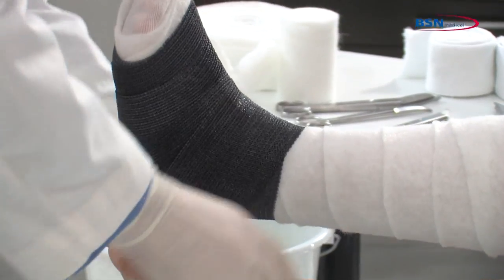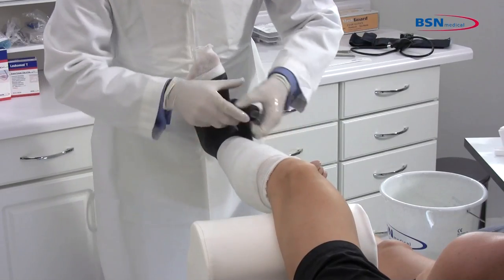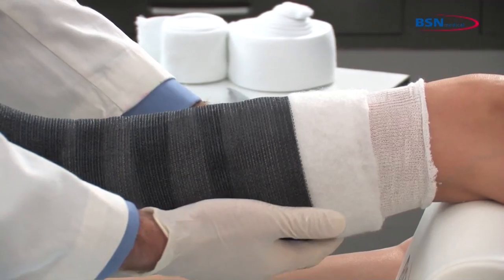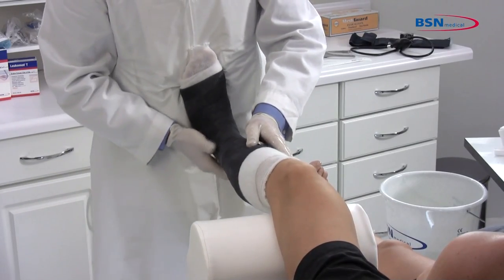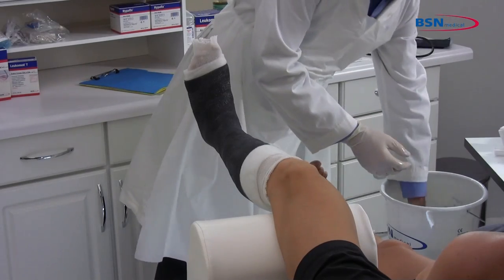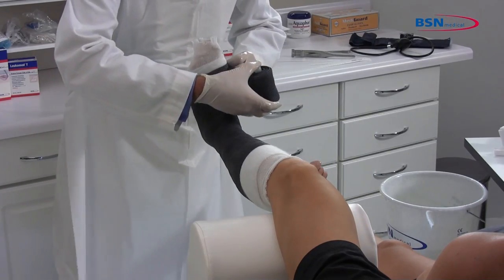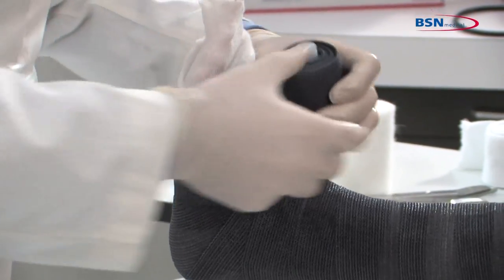Continue with 50% overlap toward the knee. Be sure to keep the cast tape below the fibular head, as pressure on the fibular head could cause neurological complications. Take a second roll of the same size cast tape, dip it in water squeezing 1 to 3 times, then remove from water and squeeze 1 time to remove excess water.